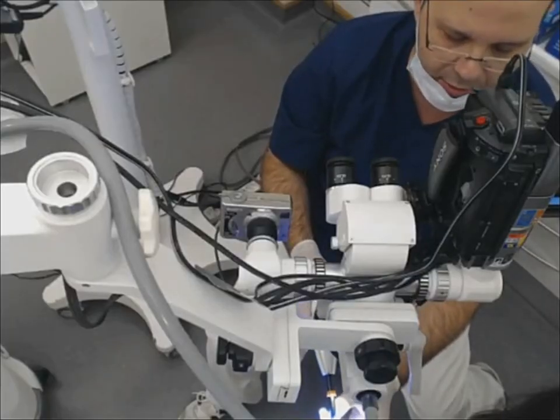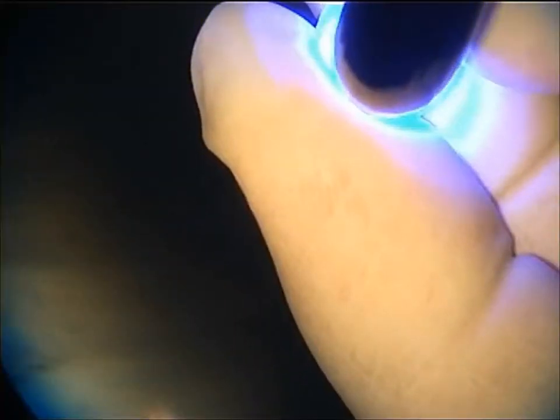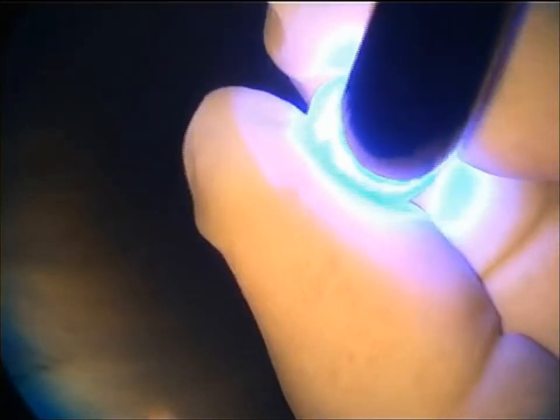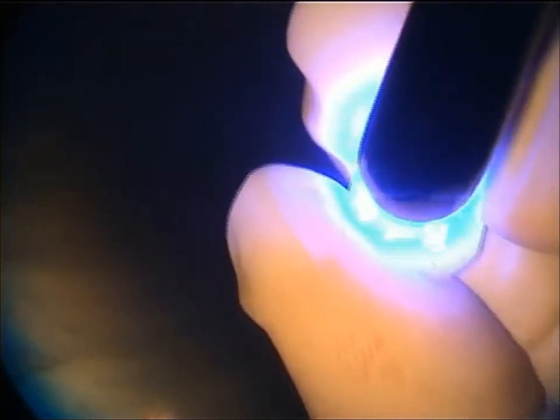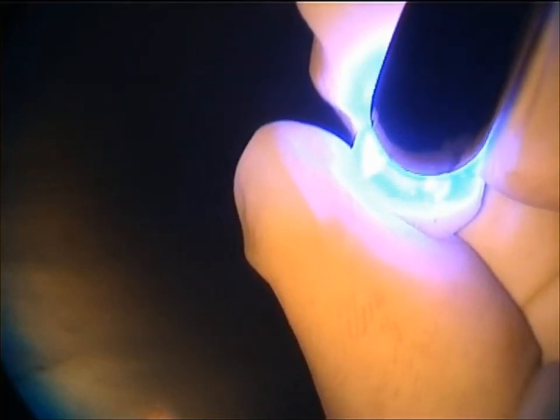So I have almost finished my individualization. Now I just need to pass the wheel, the last wheel for polishing with the chamois in the middle, and that's it. And then I'm gonna sandblast the inner surface, apply the Scotchbond Universal, prepare the tooth, and make the cementation.